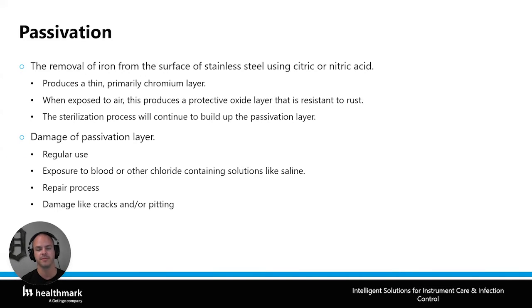If you have a contracted instrument repair vendor, make sure that they know how to repair the instruments, but also repeat the passivation process if needed. Also, damage like cracks or pitting can inhibit your passivation layer as well.